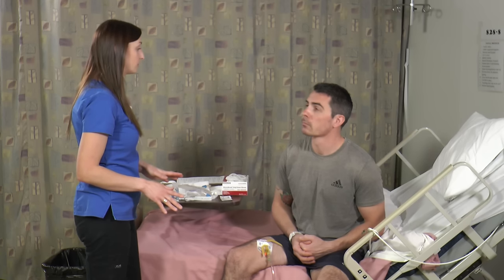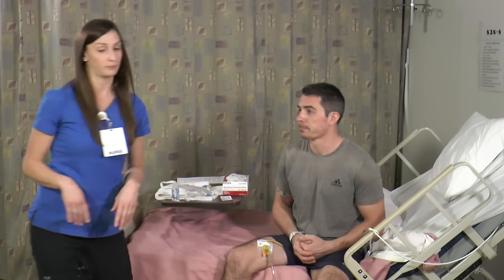Now, before you do any care, catheter care, or care of your drainage systems, the first thing you want to do is wash your hands. So I'm going to go step out and wash my hands. Okay.